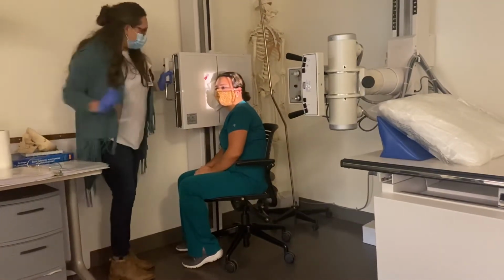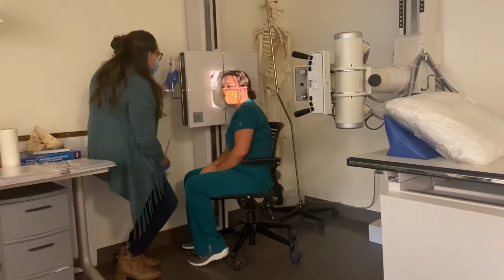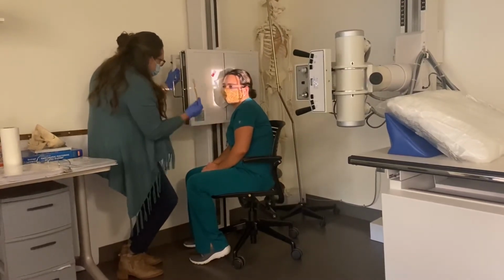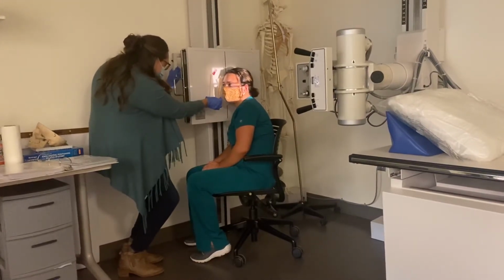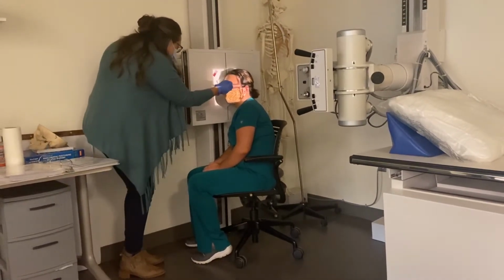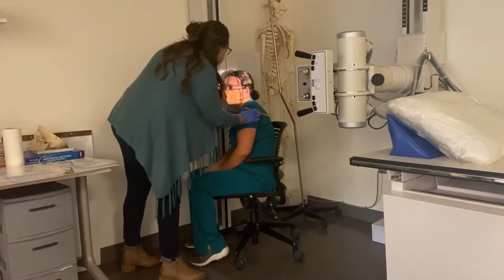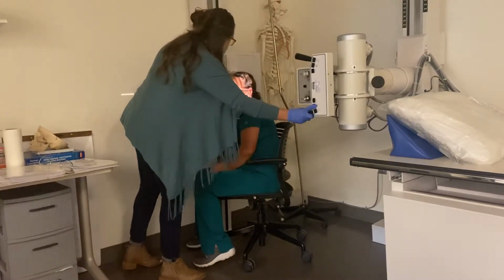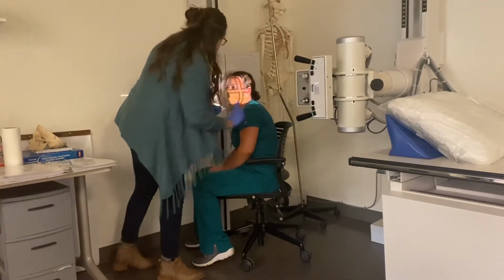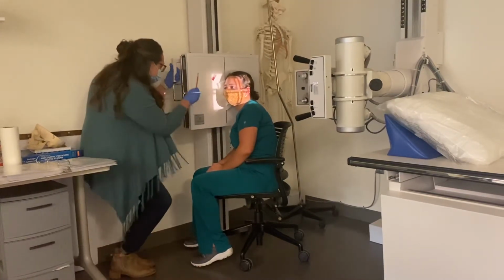I wanna make sure that those interpupillary lines are perpendicular. So I'm gonna have my patient kind of tilt your head out just a little and then look that way just a little. Good. So mid-sagittal plane is now parallel. Interpupillary line is perpendicular. It changed my centering a little bit, so I'm gonna move her just slightly back. Sorry, I'm trying to push on you. And this is gonna lower down just a little bit. Once I move her, it's really important to come back and check.